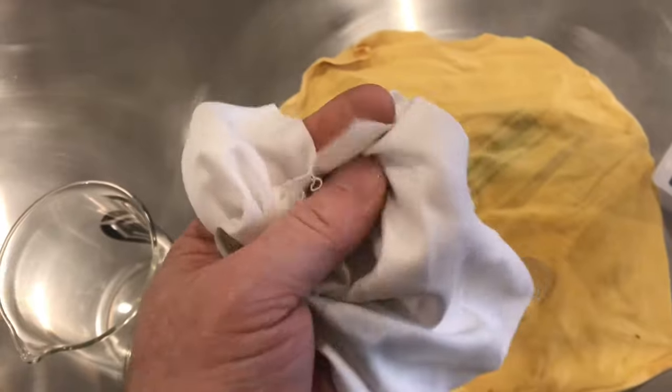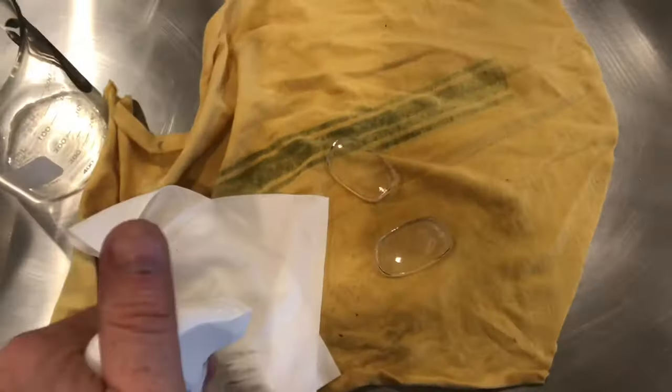Here's a rag that usually comes with your eyeglasses — it's a lot softer and it won't scratch the lenses as much. You can already see a lot of that coating is starting to be removed. Keep soaking them down with the alcohol.